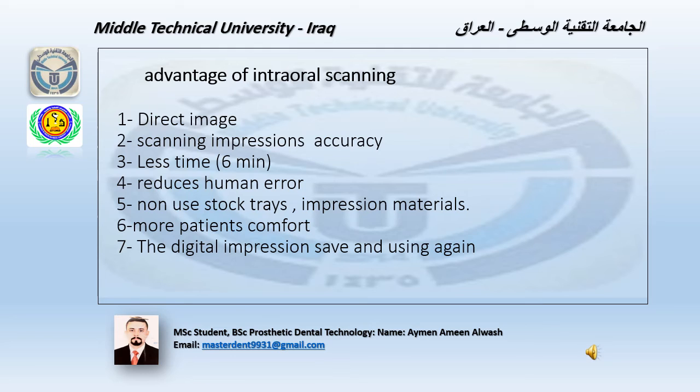Advantages of intraoral scanning: Number 1, direct image وبالتالي راح أتجنب استخدام الامبريشن ماتيريال اللي نستخدمها بالتراديشنال واي. Number 2, scanning impression accuracy أكيد راح يحصل على more accuracy more details. Number 3, less time, about 6 minutes فراح يصير عندي less chair time. أما بالنسبة لل number 4 reduce human error طبعا أقلل من نسبة الأخطاء.